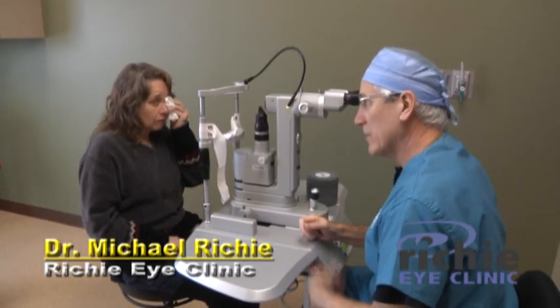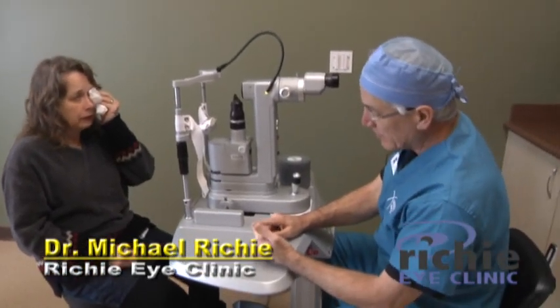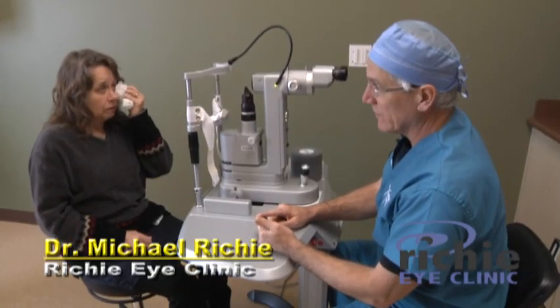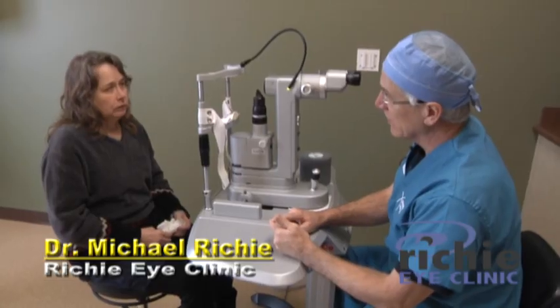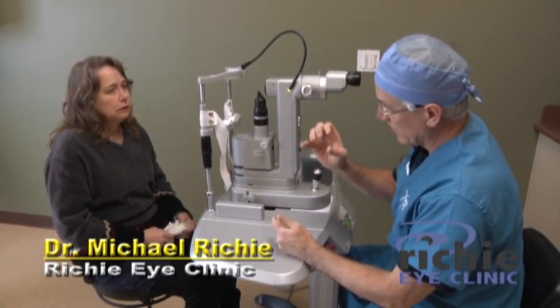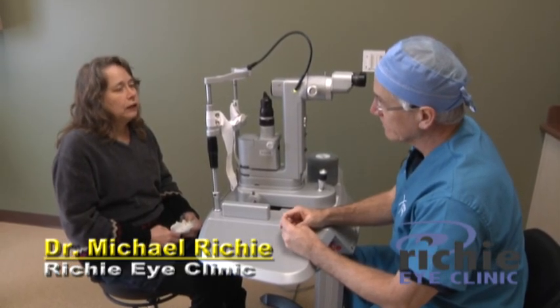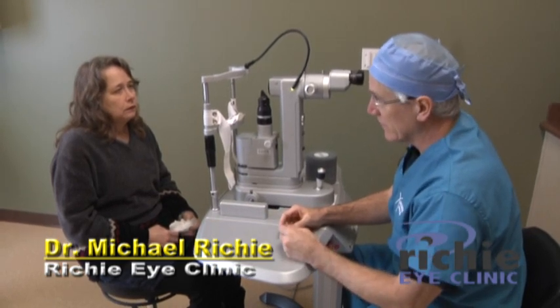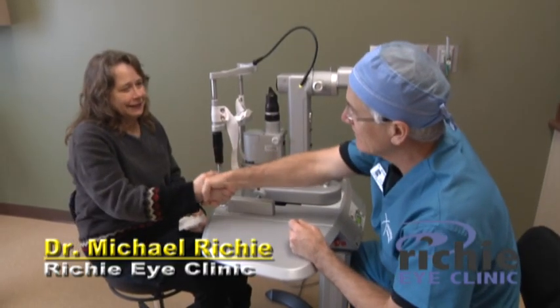Your eye is going to feel kind of thick and goopy — sit back, we're done. It'll be blurry all day today because your pupil is dilated, because we shined a bright light at you, and because when I use that protective contact lens I put a jelly goop on there to protect your eye. The pupil will come down over the course of the next 12 hours. As your pupil comes back down and the eye clears out the jelly goop, your vision will improve. The ladies will come in in a moment and go over the eye drop routine with you and you'll be good to go.